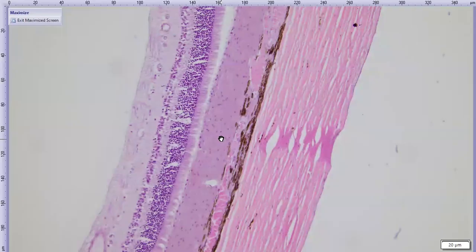I don't know if that's correct or not. But this is archetypical of a nocturnal retina, and using the thickness of the different layers is quite useful in mammals. It gets a little bit less useful in reptiles, and we'll talk about that again when we come to geckos.